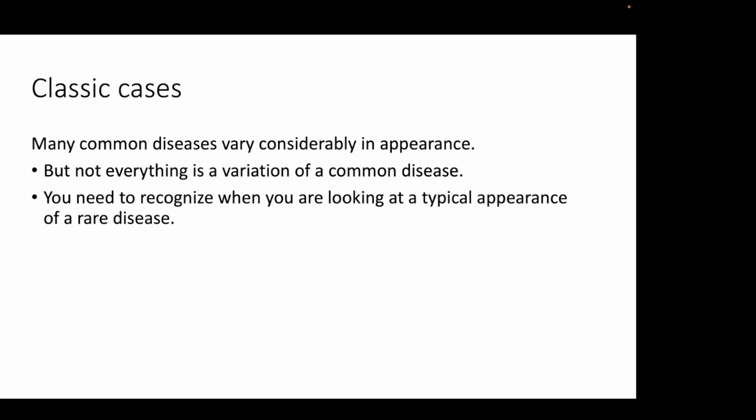But some people tend to think immediately of the exotic things, and other people tend to call everything some variation of normal disease. The best way to improve your diagnostic capabilities is to know what a lot of unusual diseases look like. And if you think about our whole business of radiology, it's really just a game of recognizing things. And oftentimes we see things before we're even aware that we're looking at them. Our brain processes the imaging, and we get a sort of feeling that something's not right.